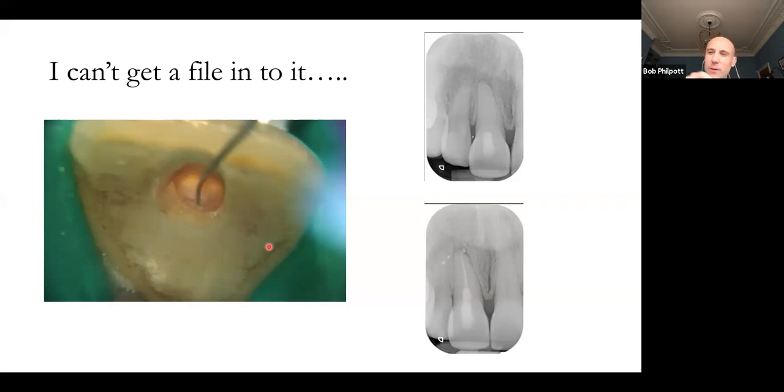Get a scissors, because you'll have a ton of bent hand files at this point. And okay, at their cheapest, they're £1.75. But why do you want to waste them? Think of the environment if you're not thinking about the money. Why do you want to keep throwing away the files when 90% of the length of it is actually usable? So you can cut the bent bit off and use that and twist it into this area.